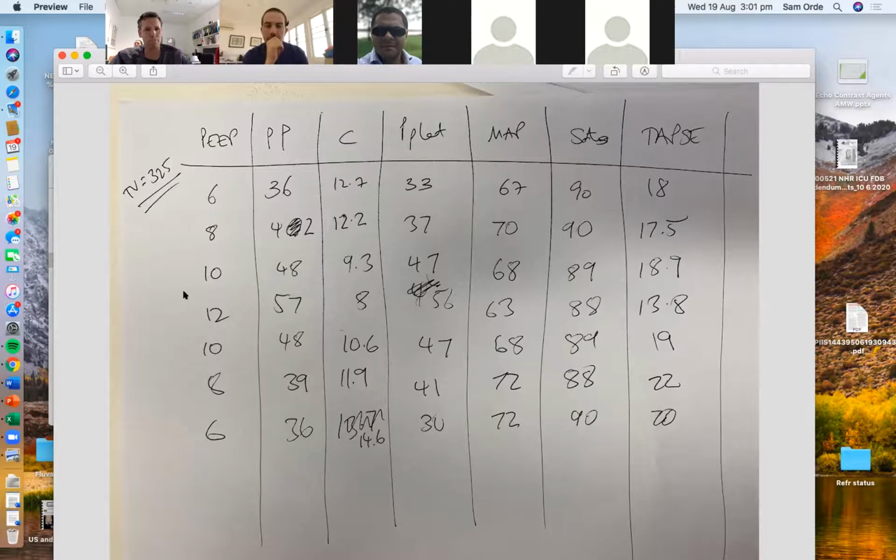And whenever I'm doing these maneuvers, I would put the pressure volume loop up, rather than having the standard curves. Then I would have a reference loop, and then observe which direction the lung compliance is going, even with single manipulations of 2 or 3 centimeters of water of PEEP. Fascinating. I'd love to see how you do that on a ventilator. You must show me. Yeah.